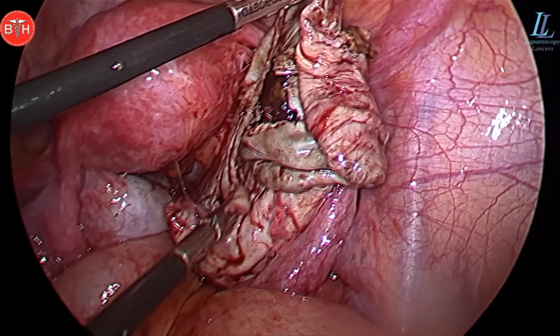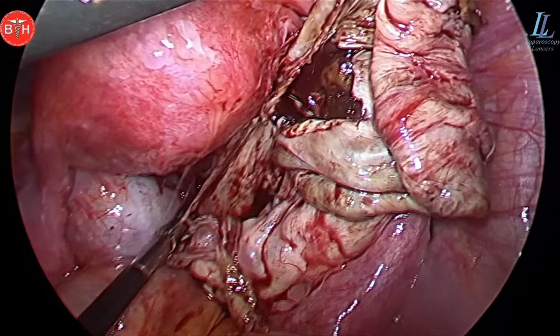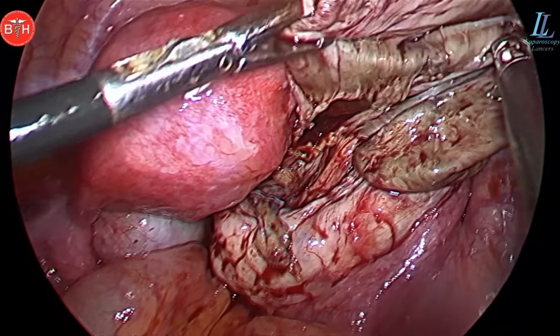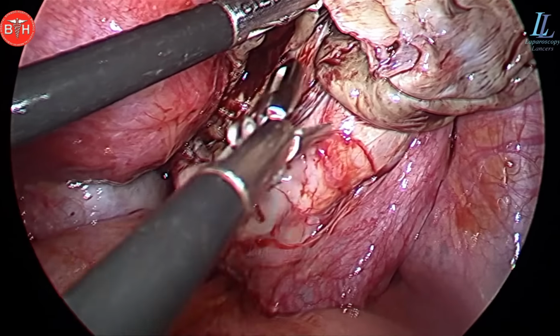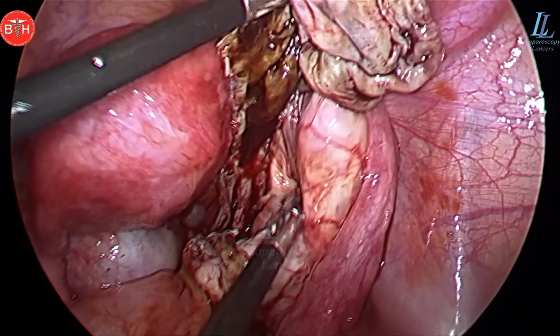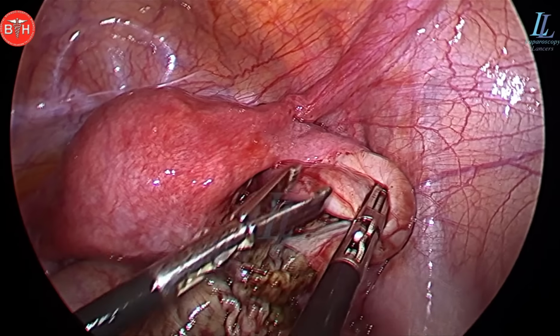So that's the right ovary that we'll preserve. And there you can see the patient is planning for a pregnancy obviously, and once we remove these endometriotic cysts, her symptoms will improve, the pressure on the fallopian tubes will go down, and once she is pregnant, the symptoms of pregnancy will disappear. So coming to endometriosis again, is endometriosis curable?